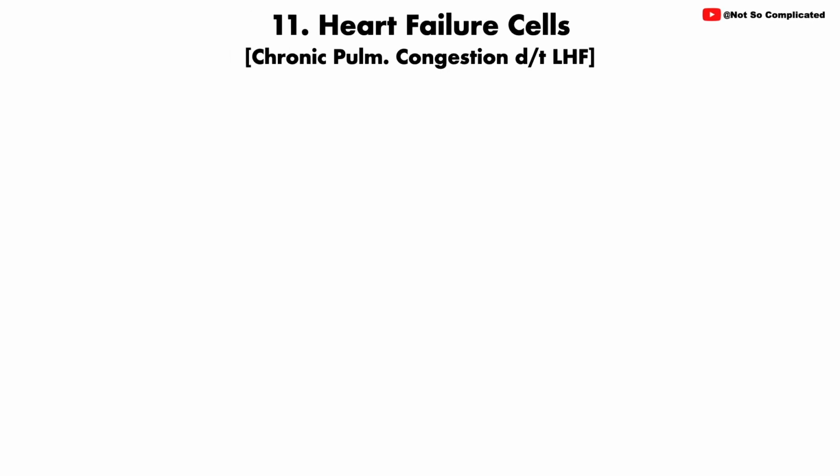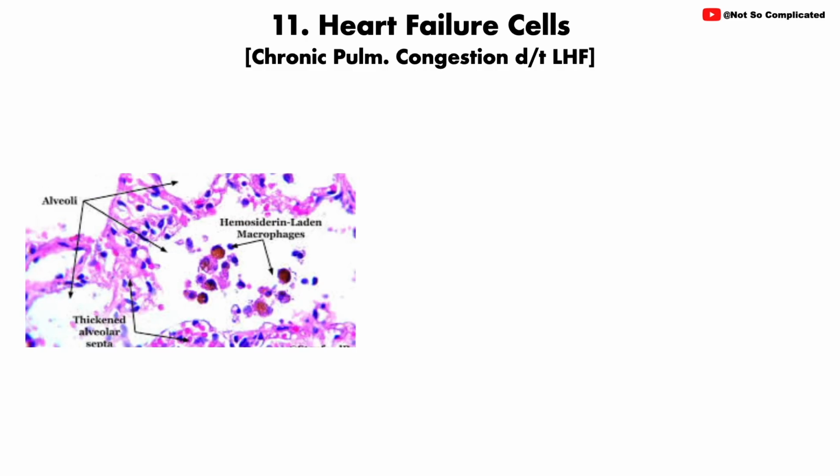And then heart failure cells, you must have heard about this. This is seen in chronic pulmonary congestion due to left heart failure, and they look like this, and these are hemosiderin-laden macrophages.